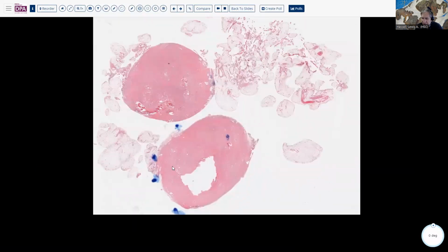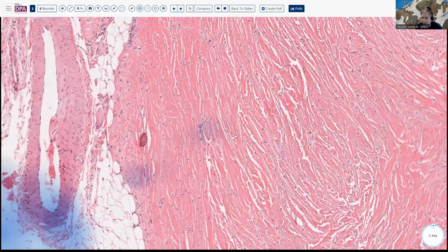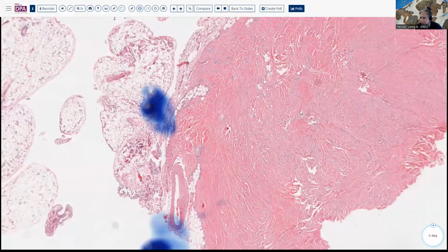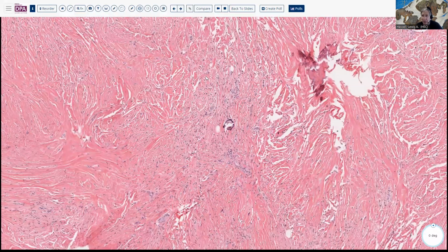And in this particular slide, the calcifying areas are quite rare. Here's one here, nicely highlighted with the dots. Probably one that was here. And I think there was one other one here, over here, perhaps. Yeah, right here you see the one we imaged for the lead slide here.